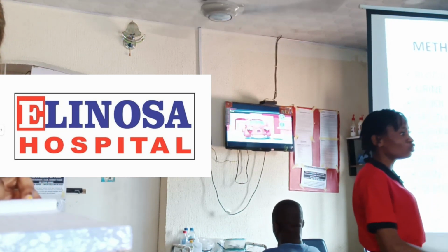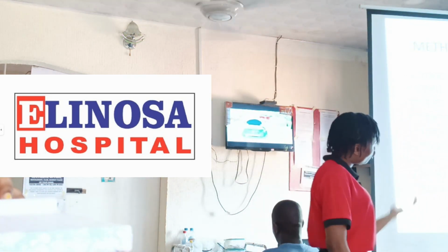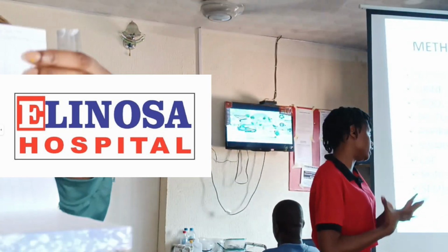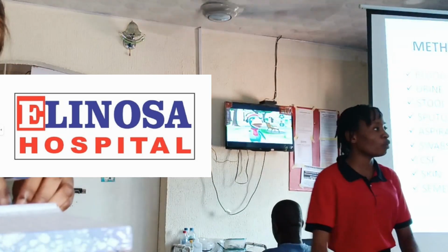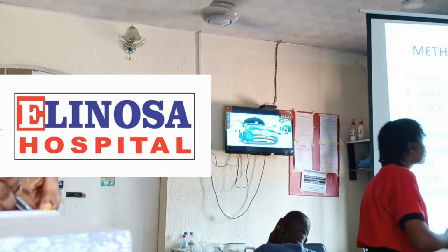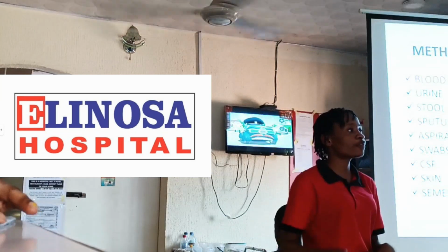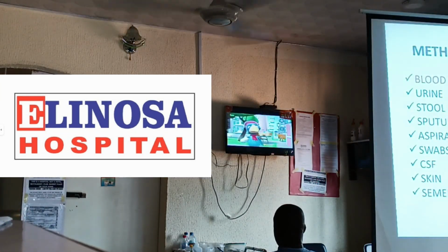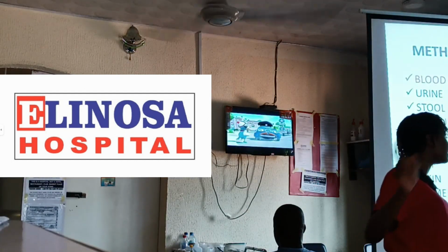Then swabs, okay, we all know this one. Swab samples are named depending on where the sample is being collected from. If you use a swab to collect the sample from the walls of the vagina, it's called a high vaginal swab. If you use it to collect a sample from a wound, it's called a wound swab. We have throat swabs, nasal swabs, and all kinds of swabs. And we use these swab samples to check for the presence or absence of microorganisms, for example, organisms that cause infection, like Candida albicans that causes candidiasis.